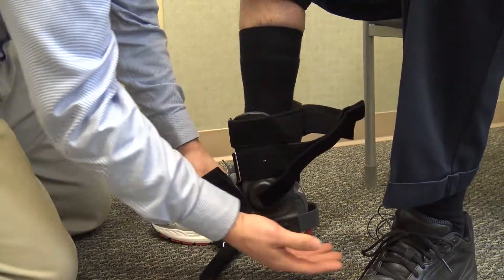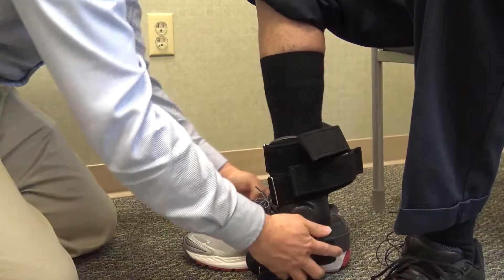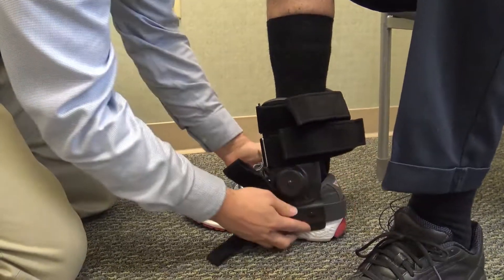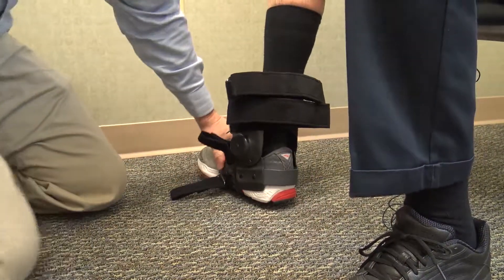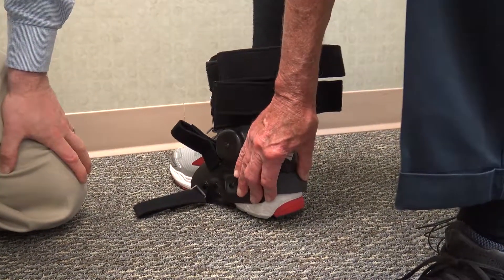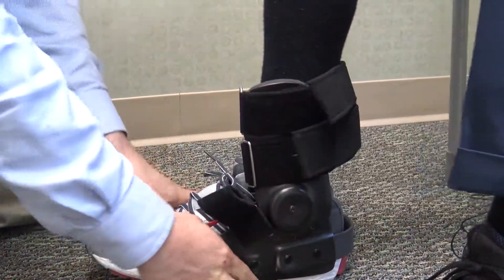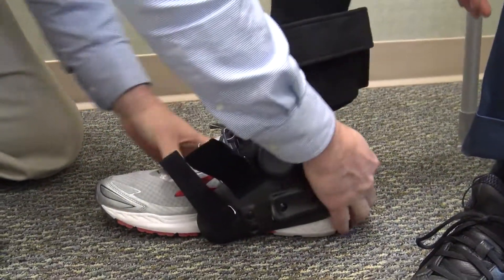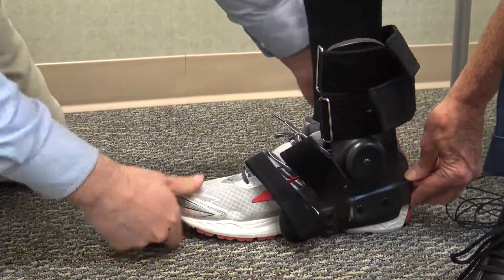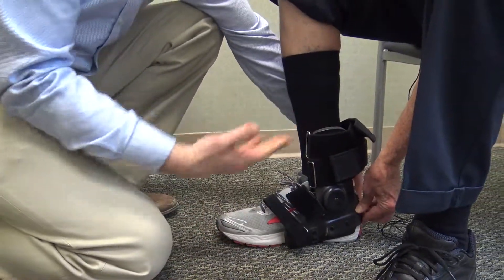Put it on normal like you think you would get it on there. The patient's knee is about 90 degrees and their foot is on the floor. Then you just bring it back — see how he fit it on there? It locks in right there, it'll catch, and it goes down about 30 degrees. Now he's going to pull this forward and make sure that's snug. You may need to bring the knee back a little — maybe 100 degrees instead of 90 — to get it on.